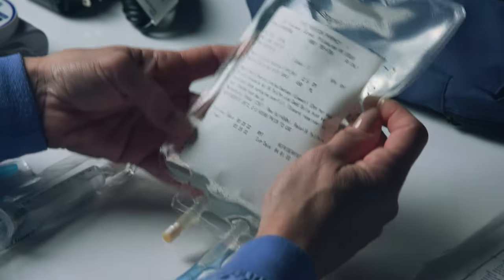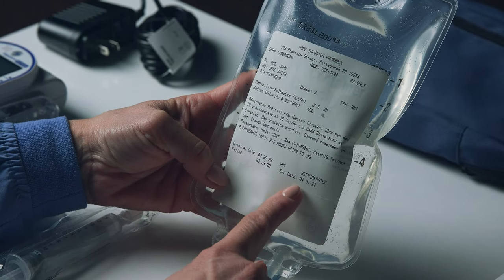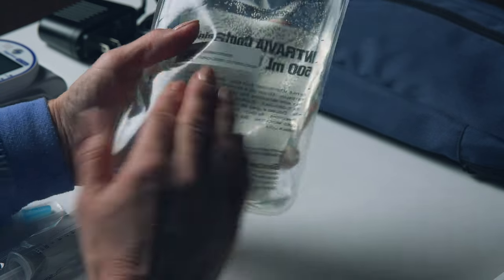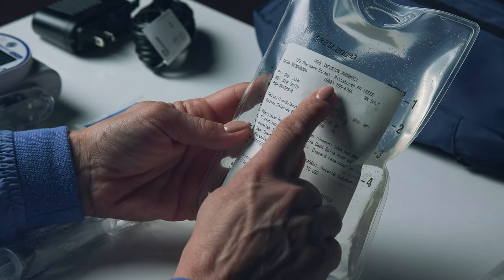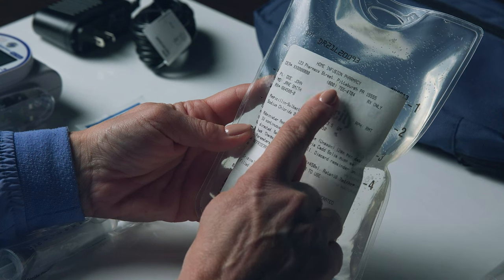Check the medication prescription label on your medication bag for the correct patient name, expiration date, drug, and frequency. Inspect the bag of medication for any leaks or particulate matter. If you find any abnormalities in your medication bag or label, contact your pharmacy at the phone number on the top of the prescription label.